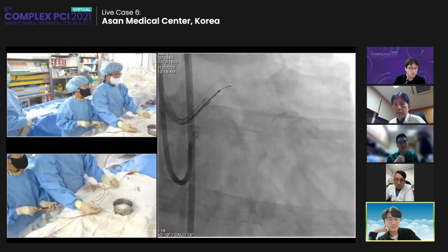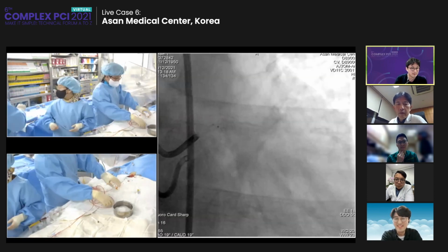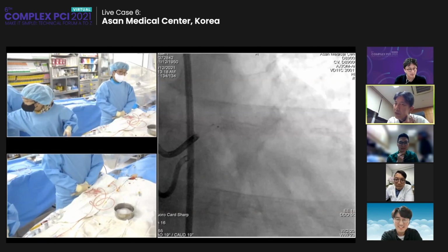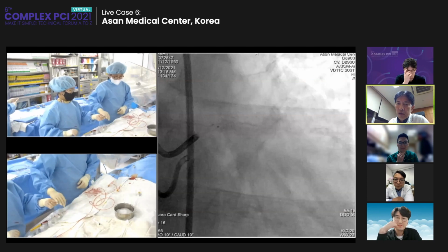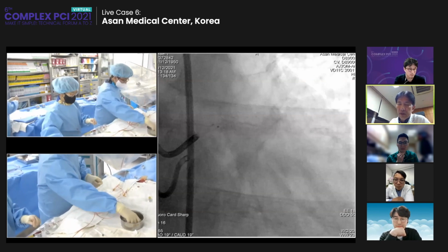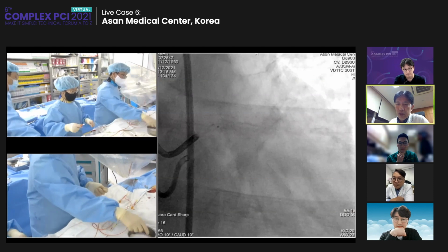How about you, Dr. Muramatsu? We want to learn lots from you. Now, the first wire I want to use is, first of all, a simply controllable wire. I usually use the Corsair Pro. But of course, if I do the parallel wire technique, I usually use a double-wire, two-channel, two-way catheter, for example, the Crusade or Sasuke.